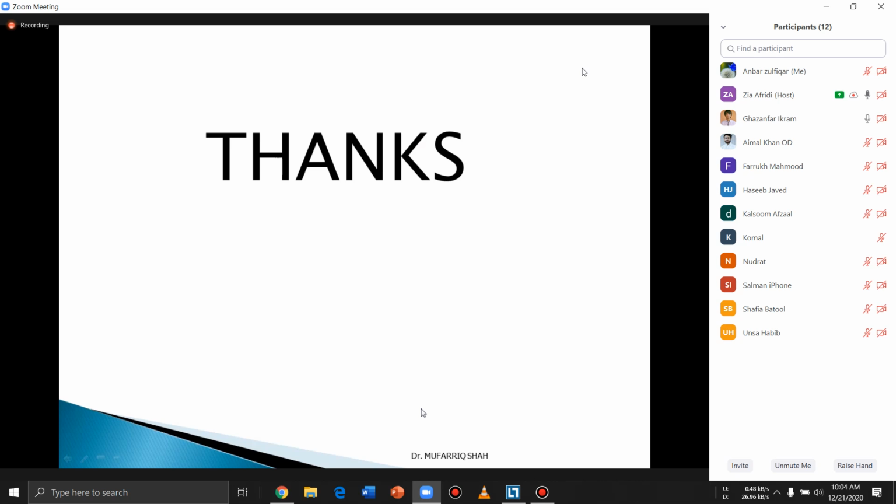تو یہ اب میں نے آپ کو بتا دیا کہ جب کارنیا میں اوپیسیفیکیشن آ جائے، لیکن اس کی ایگزامپل اگر میں آپ کو PCO سے دے دوں تو آپ کو زیادہ کلیئر ہو جائے گی. ٹھیک ہے سر. آپ نے پیشنٹ دیکھے ہوں گے کہ کیٹریکٹ ایکسٹریکشن کے بعد جب IOL لگاتے ہیں اور PCO تھکننگ ہوتی ہے تو سلٹ لیمپ ایگزامینیشن سے آپ کو کلیئر پتہ چل جاتا ہے کہ کچھ جگہ میں PCO کو جج کرنا آسان ہے، اسی میں اس کا ایگزامپل دیتا ہوں کہ آپ کے لیے سمجھنا آسان ہو جائے گا.